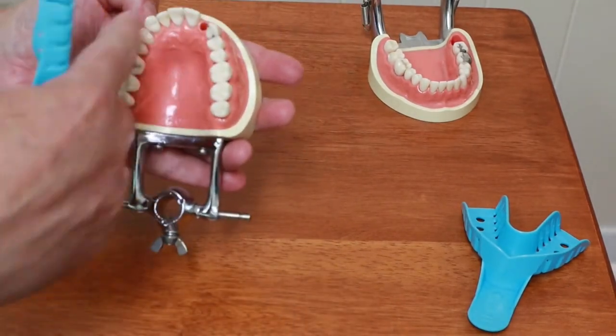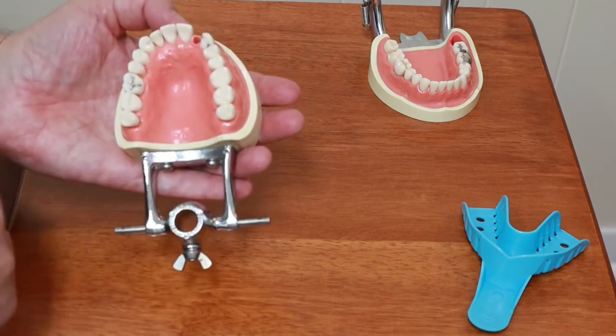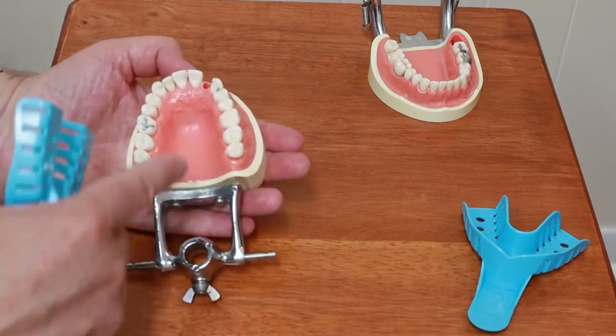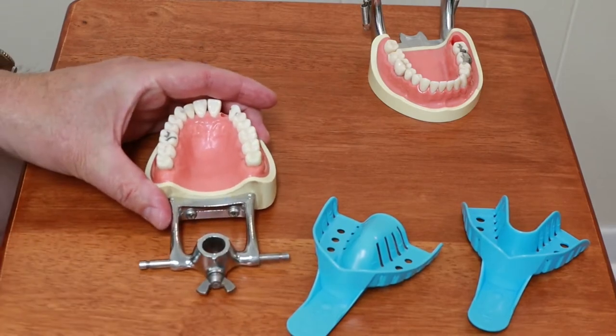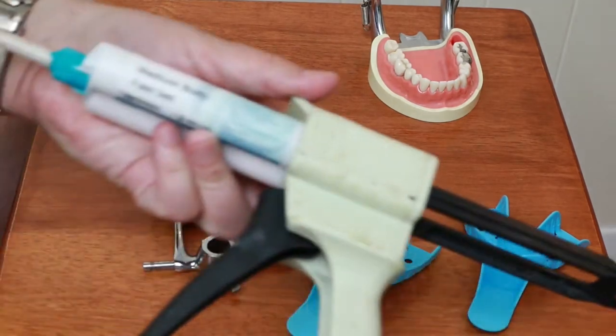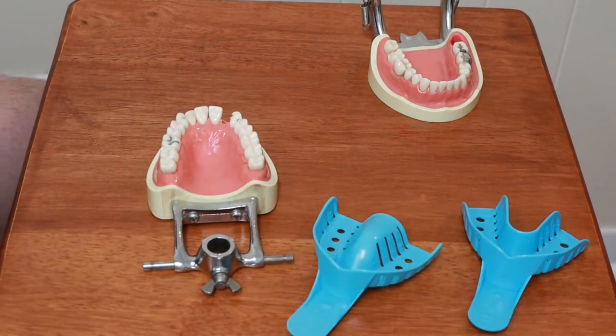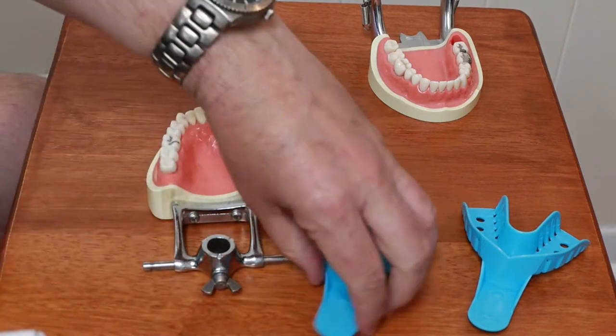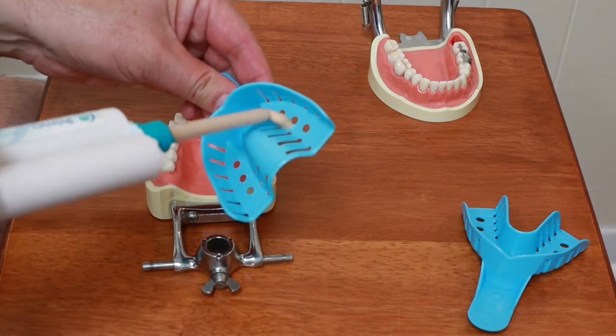For the upper mold, since this is where the Maryland bridge is going to be, I'm going to use a material called vinyl polysiloxane. It's a rubber material that's going to give me better accuracy and a very stable model. It comes in this dispensing gun, just fill up the tray.